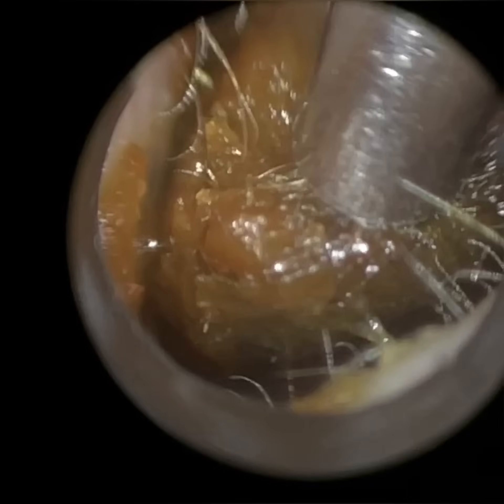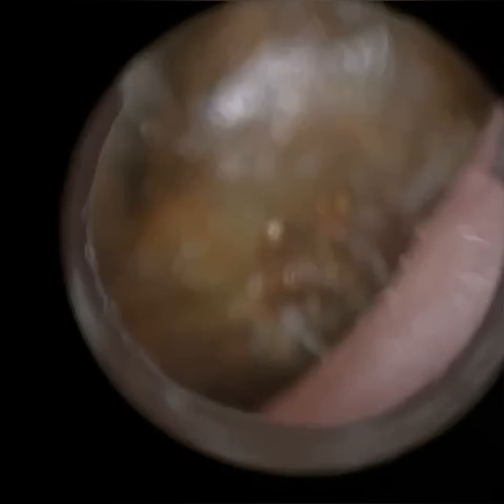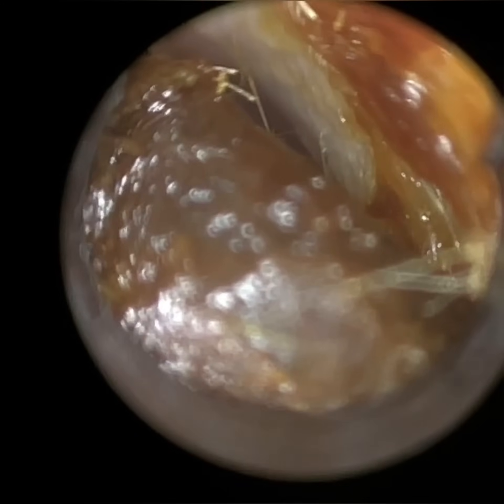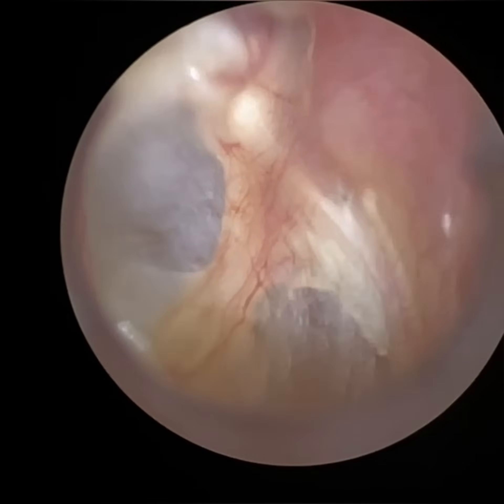We have here a patient who attended with bilateral, completely occluding and impacted earwax. They are a hearing aid wearer and a few days ago they suddenly stopped hearing and their family members were very concerned. At one stage they were suspecting whether the patient had suffered a stroke, because they were not able to hear or even communicate back as a result. They attended the NHS where they got their hearing aids, who examined their ears and advised the patient and their family that they've got occluding wax, and that is the root cause behind their sudden loss of hearing.